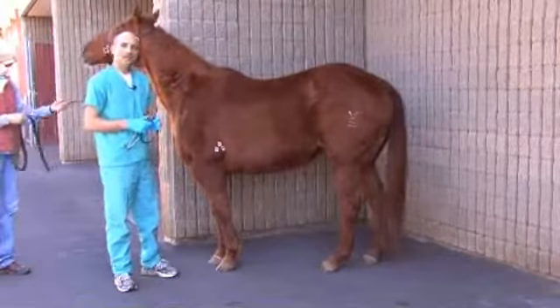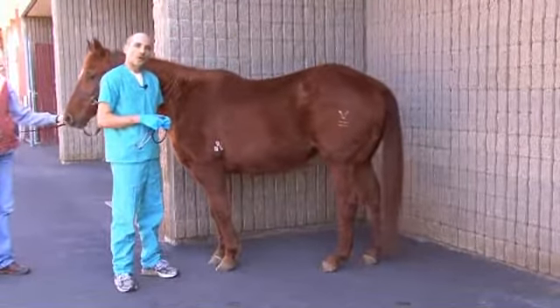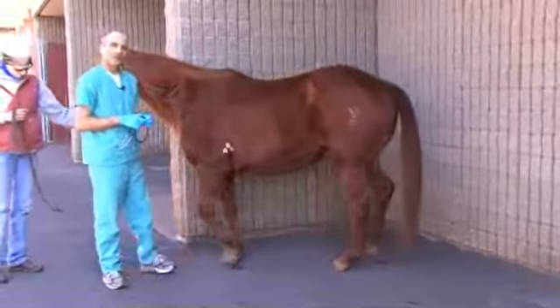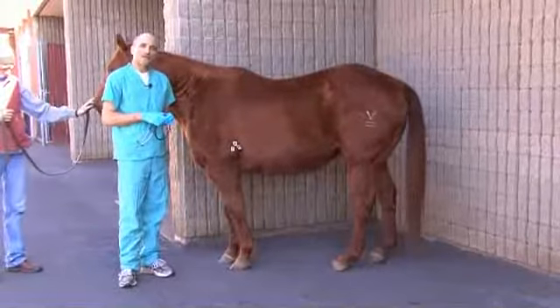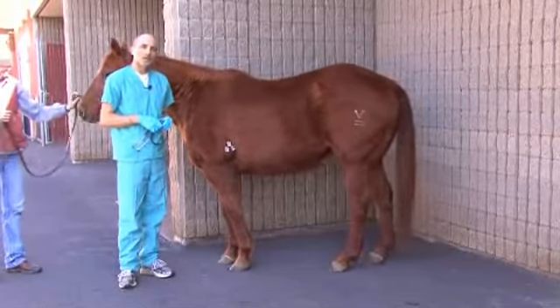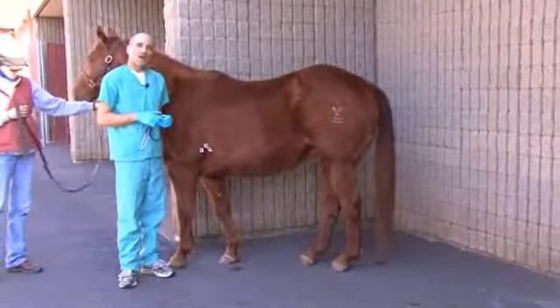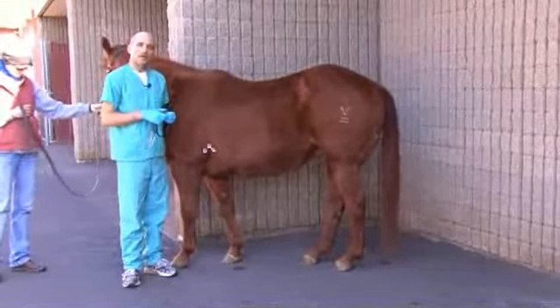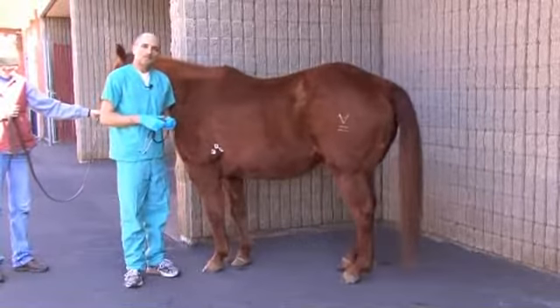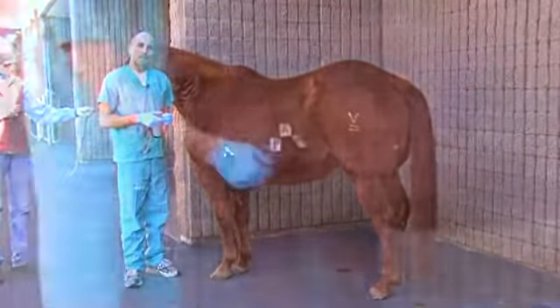Lastly, I'll be reviewing the valves that exist in a horse's heart. Those are the pulmonic, aortic, and mitral valves, which are best heard on the left side, and finally the tricuspid valve, which is best ausculted on the right side. To keep things simple, though, the most important thing is to find the point where heart rate can be picked up easily. Usually that's on the left side. And the most important thing to listen for is that lub-dub sound.